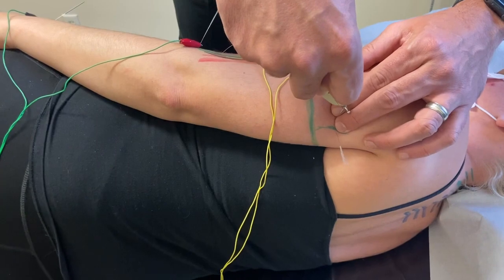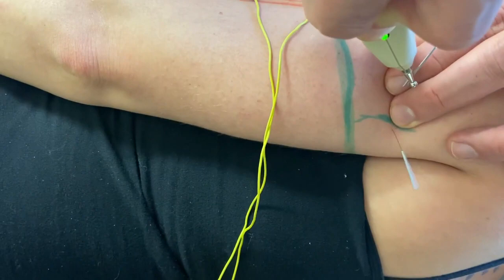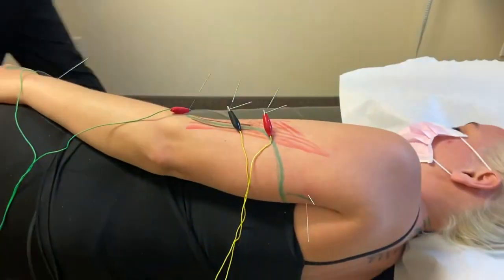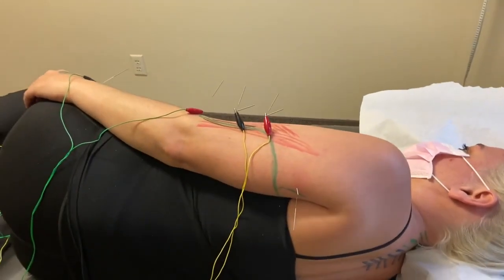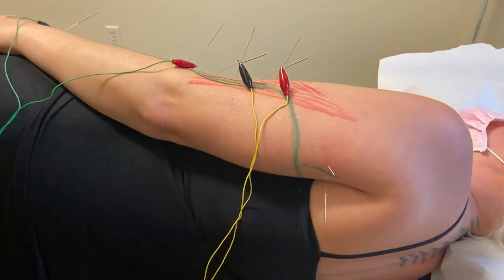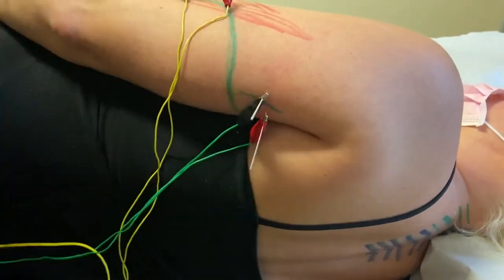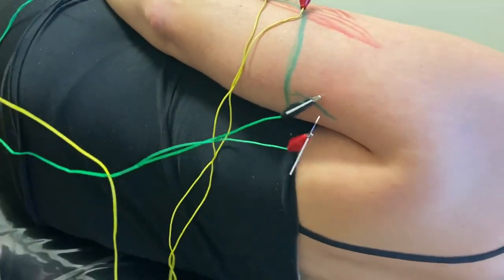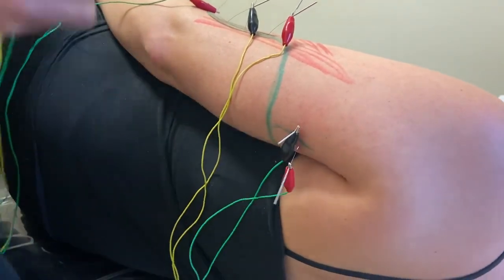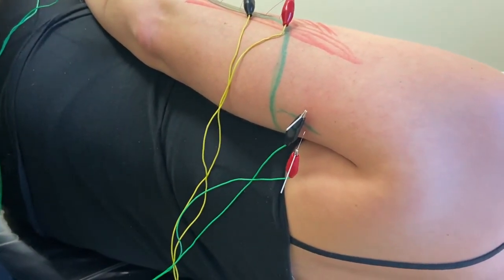You can see that moving there, moving the entire long head of the tricep. Good. That tells us we're in the right place. So what I'll do here with the 2-needle technique, and I'll still run it at low frequency. Why? I run it at low frequency because my goal is non-noxious stimulus. My goal isn't motor activation. My goal is to neuromodulate that nerve so we can desensitize it.